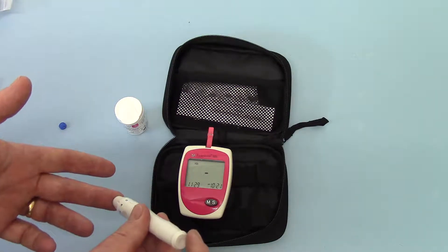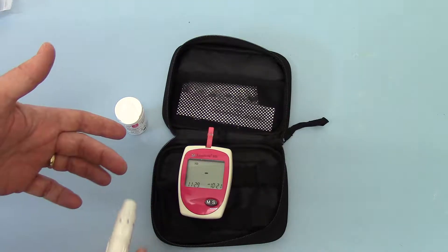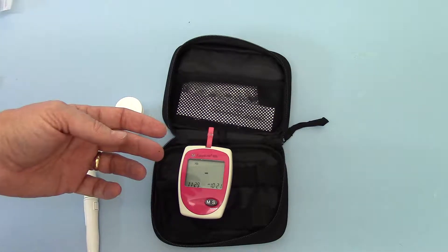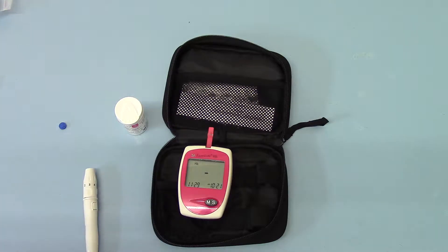Apply the lance firmly onto the finger pulp, release the trigger, and you have a blood sample forming. Now we're just going to wait for that to form — we've got a decent sample and that will take probably about 5 to 10 seconds.